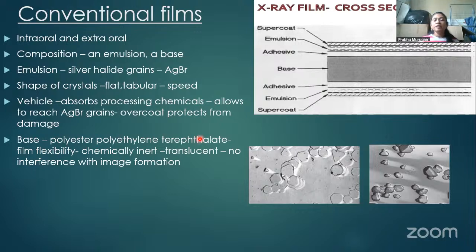Okay, you would have been using, right, a black color box. Mostly Carestream only you will be using. So these Carestream X-ray films are mostly E-speed films only. Just remember that. Okay. So the speed of the film is going to correlate with the shape of the crystals. That is the shape of the silver halide crystals, which is going to indirectly link to your radiation exposure.